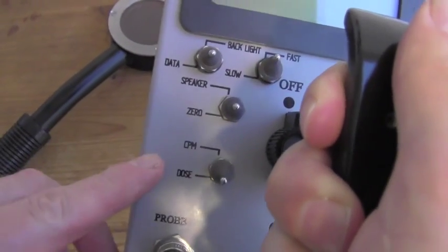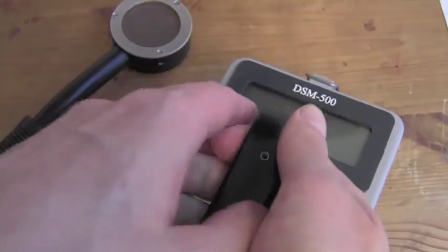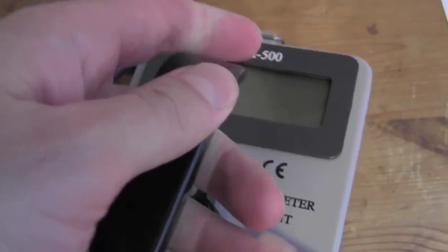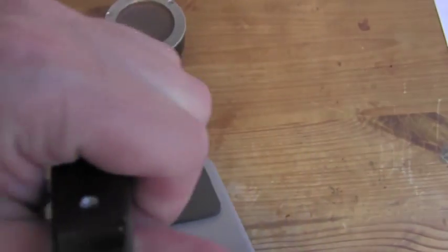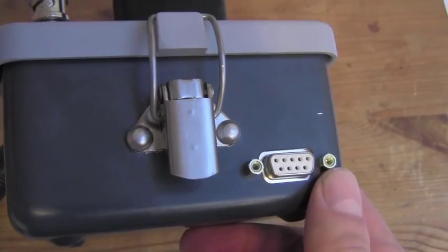Here is where we switch from counts to dose. There is an optional RS-232 data port on the back for interface with your PC.